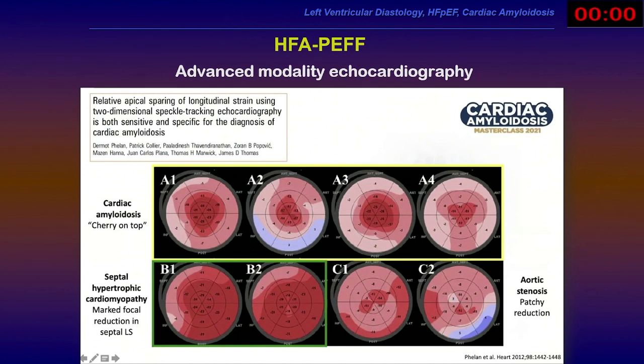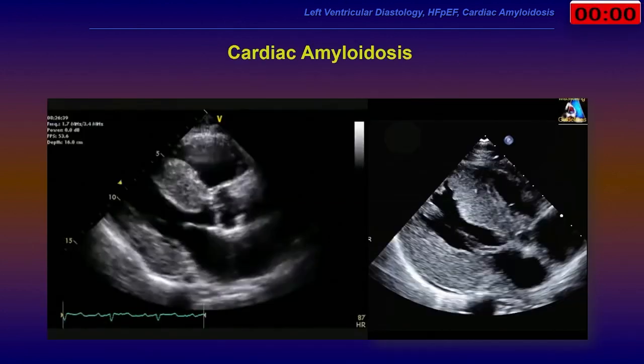But if you have hypertrophic cardiomyopathy, you have a heterogeneous appearance, especially at the site of the septum. You find a significant degree of fibrosis, and this will affect the strain rate. In aortic stenosis, the diffuse fibrosis all over the myocardium will cause this appearance.